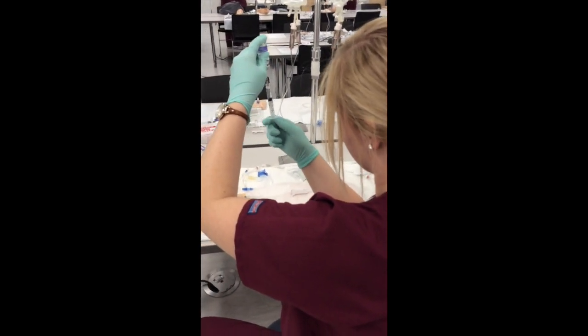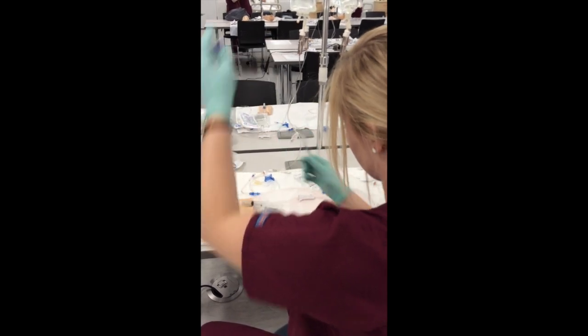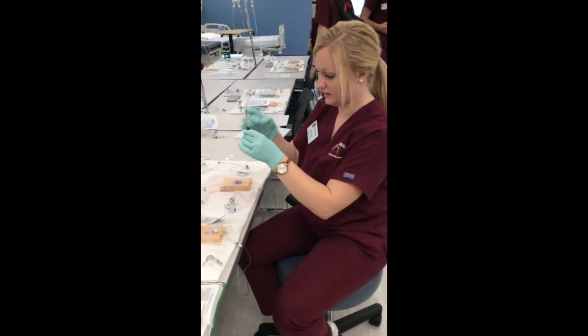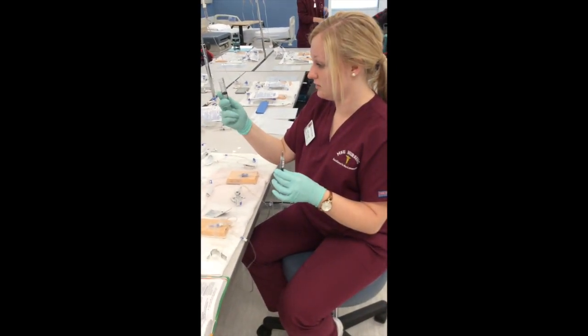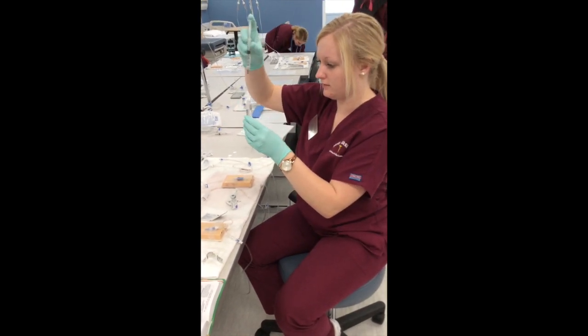Okay, I'm getting my 2 milliliters out. Make sure I get all the air bubbles out, that way I don't have to inject them into the thing later. Okay, and so I've got my flush ready. I'm going to go ahead and pull it up to 7. I'm going to go ahead and inject my morphine in there.